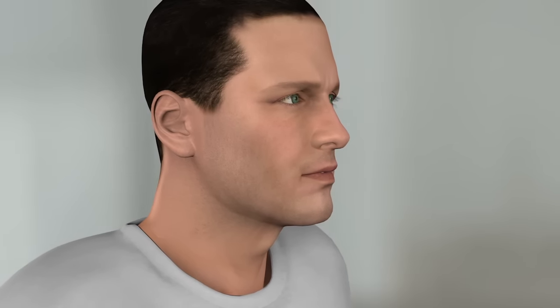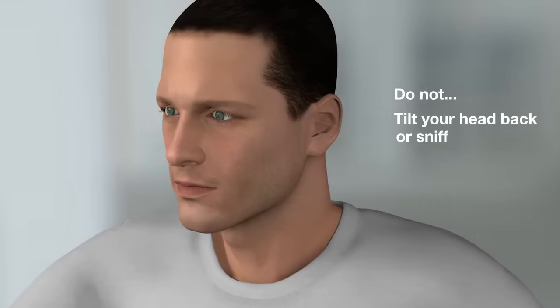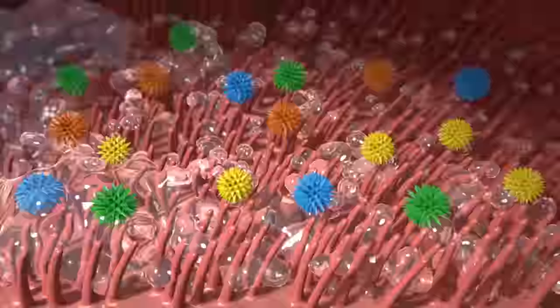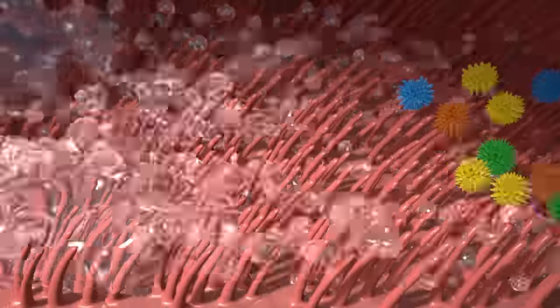Make sure that you do not tilt your head backwards or sniff while using the product to avoid sending unwanted mucus into your sinuses. The unique micro-diffusion spray gently disperses the solution into very fine droplets, washing away allergens and germ-filled mucus to help you breathe easier.